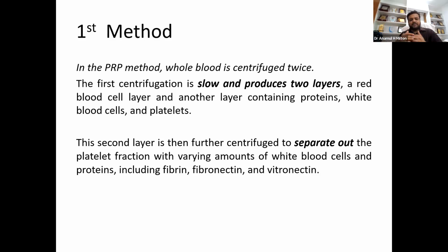and the plasma. After separating these, we collect only the plasma part and discard the RBC part. Now we collect these, and the other centrifuge is called the concentration. After collecting, it is around 10 ml. In this 10 ml, every ml has around 5 lakhs of platelets, so a total of 50 lakhs of platelets in the 10 ml.